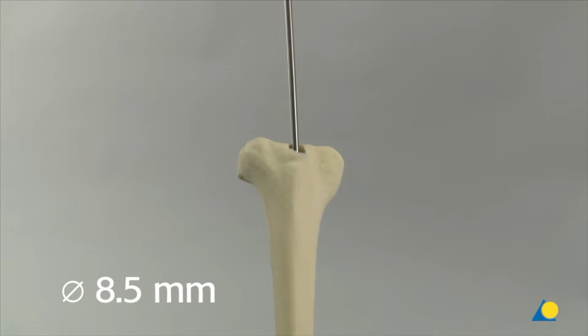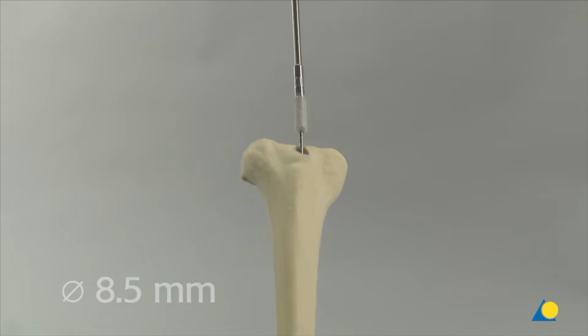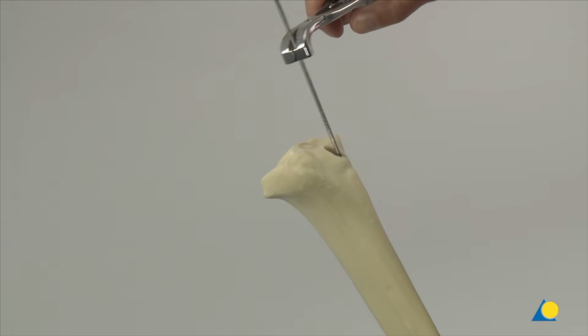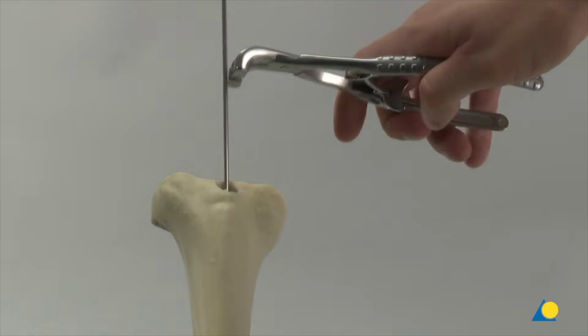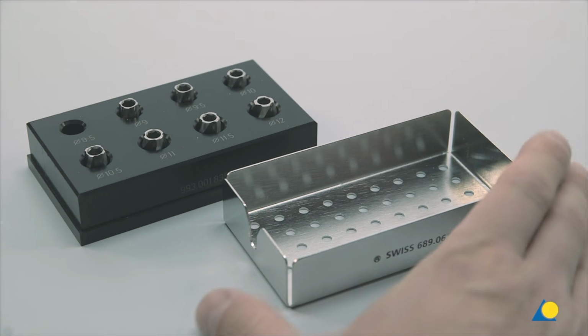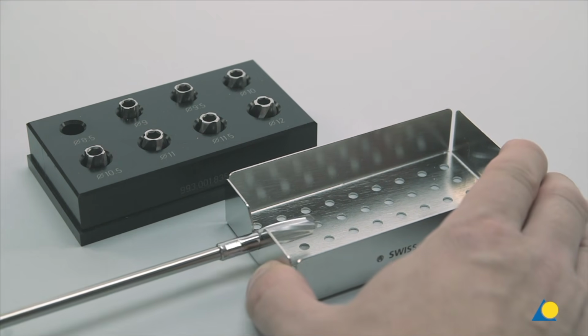After reaming, the reamer head is withdrawn from the canal until the reamer head is visible. To prevent loss of reduction, the reaming rod is grasped and held in place using the holding forceps just above the entry point. The used reamer head can be detached from the flexible shaft using the slot in the side of the removal tool.